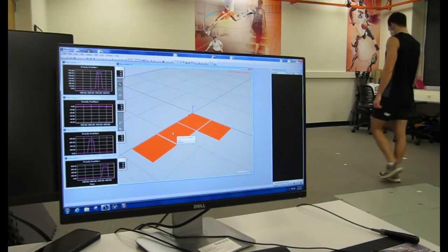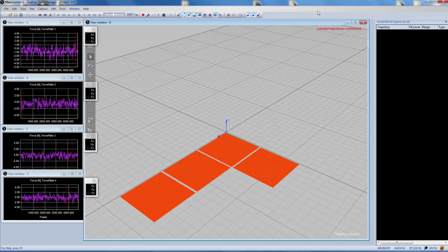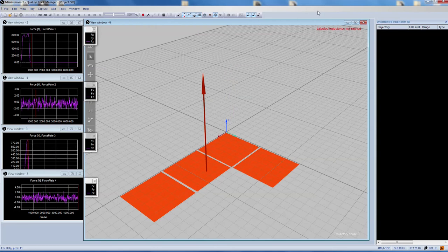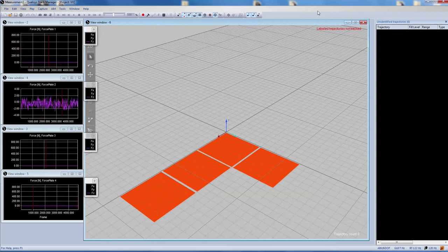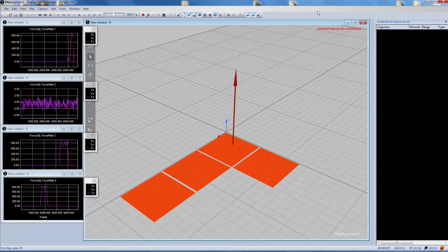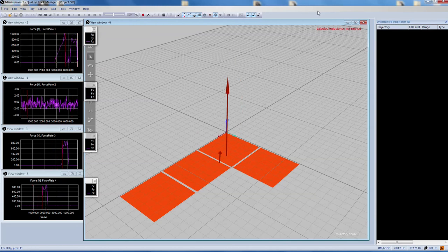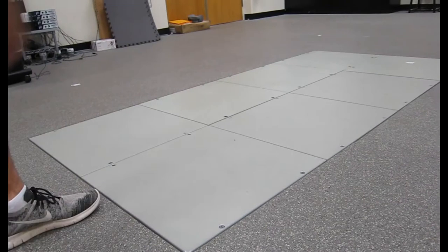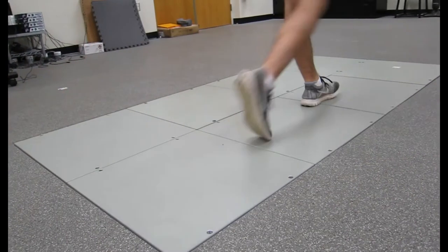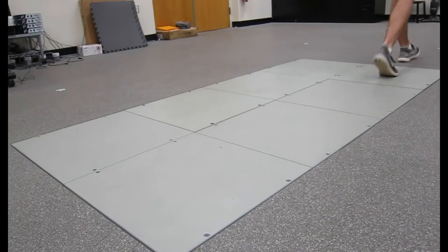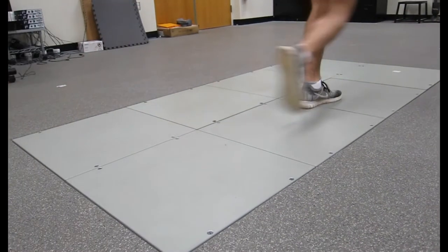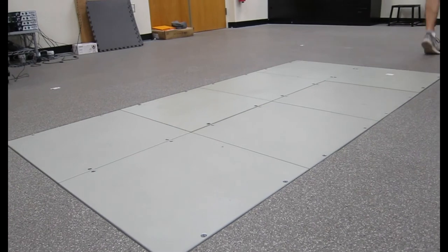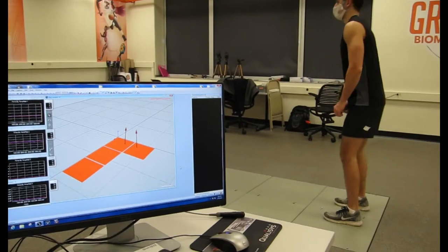The force plates gather data called ground reaction forces. This data allows us to understand how much force a person is applying under each foot when pushing off the ground as they walk, run, or jump.